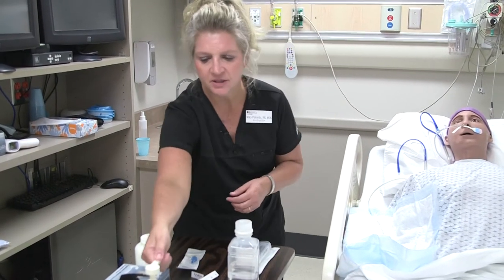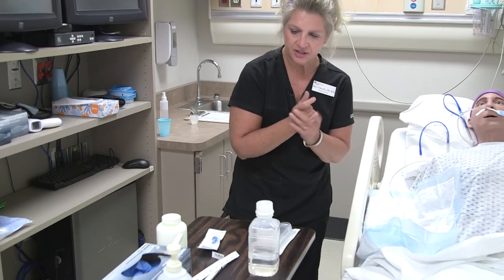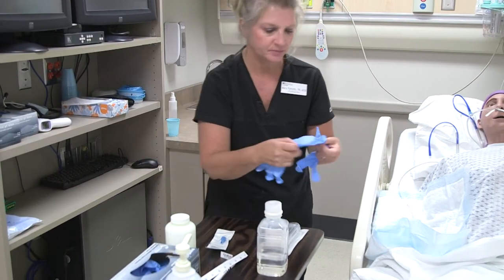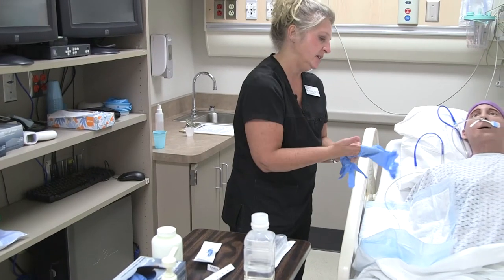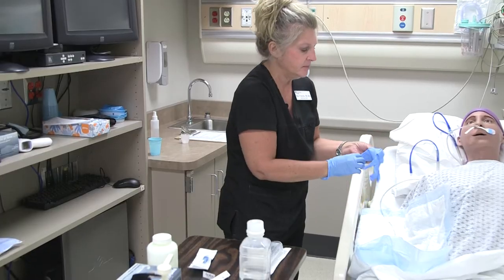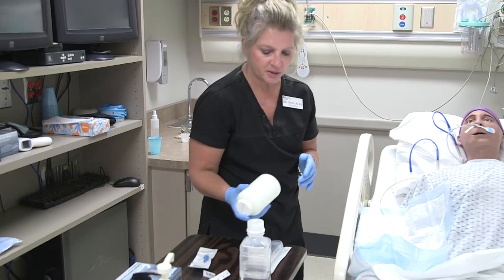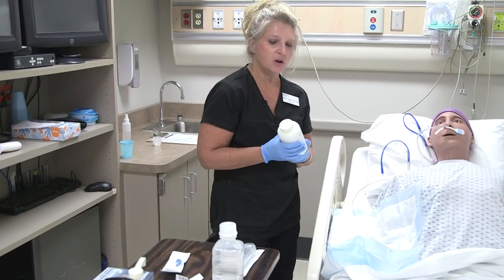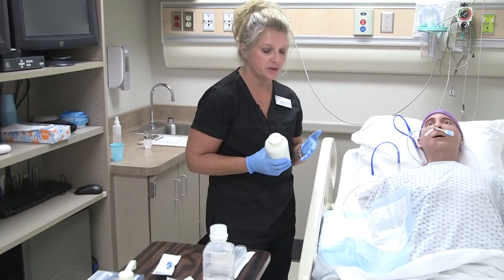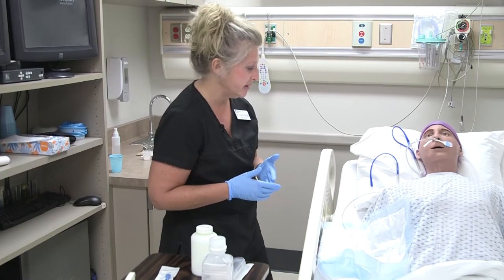I'm going to wash my hands and put my gloves on. Placement has been verified — the tube is in the stomach. I've already done my GI assessment and asked the patient the relevant questions. I'm going to provide the tube feeding formula via gravity. Note that we also have tube feeding pumps similar to IV pumps that can pump the fluid in, but I'm doing this by gravity.